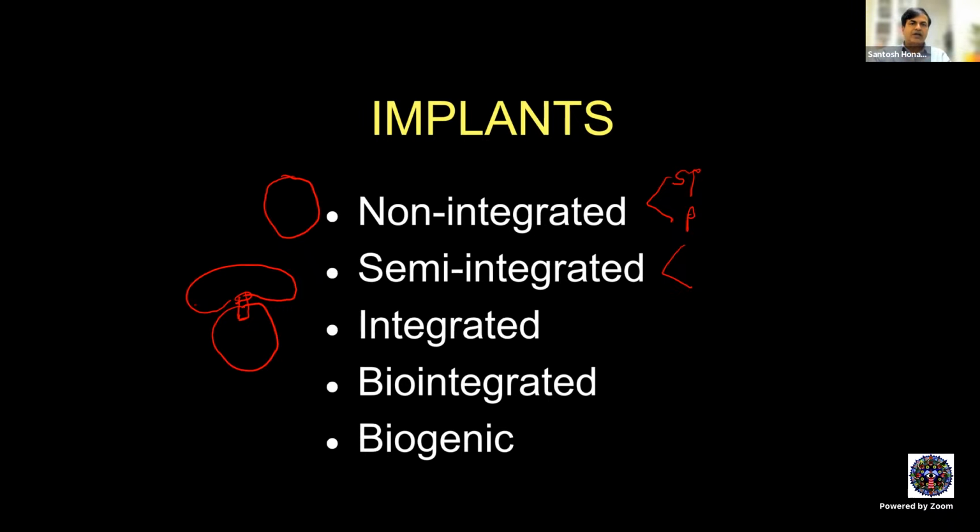It's not that an implant can be used only in one fashion. Hydroxyapatite, when it is put into the orbital cavity, obviously gets integrated with soft tissues, but it will not be integrated with the prosthesis unless you peg it. So it is a continuous process.